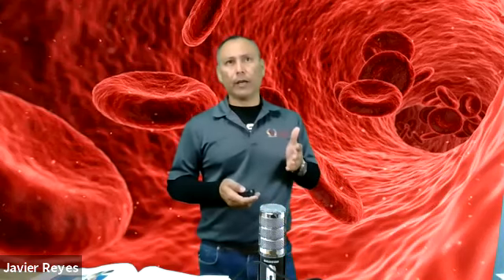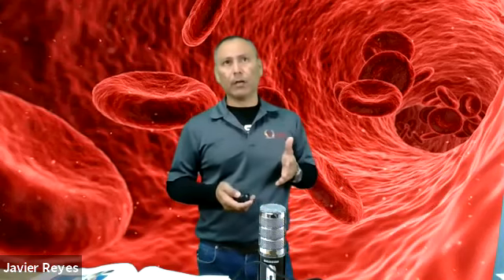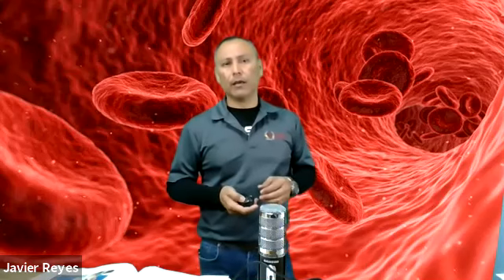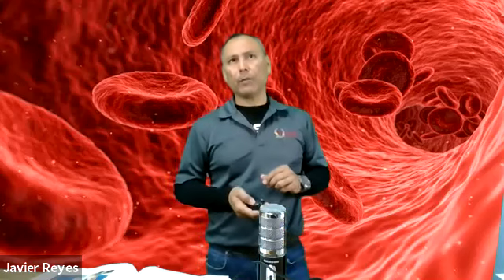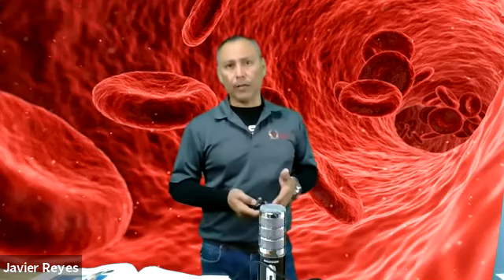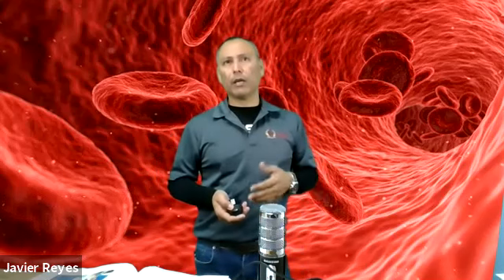However, this sample most closely resembles an arterial sample. Why? Because of the force that is being produced by your heart as it's pushing the blood into it. You're going to find that a lot of this blood is more arterial-like than venous-like. So keep that in mind. For that reason, we're going to have different reference values. We're not going to have the same values that we use for veins because they're more arterial blood. So we have to keep that in mind.